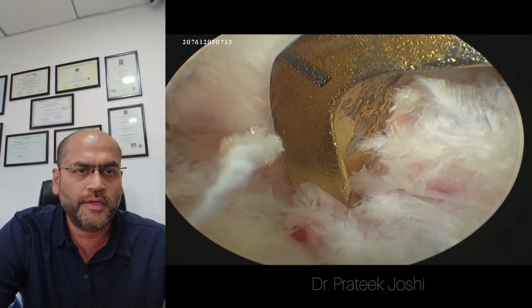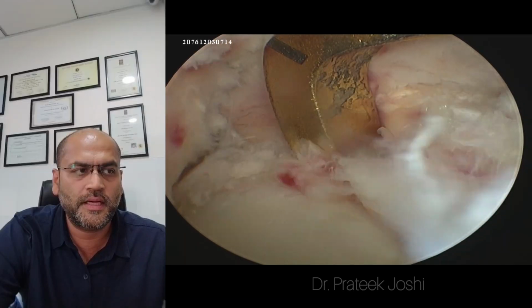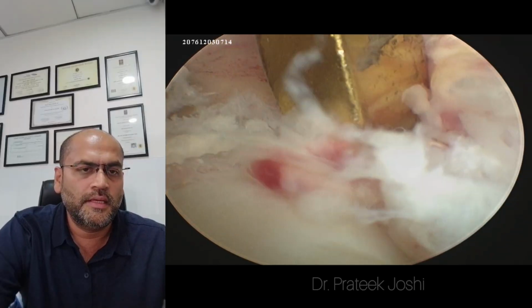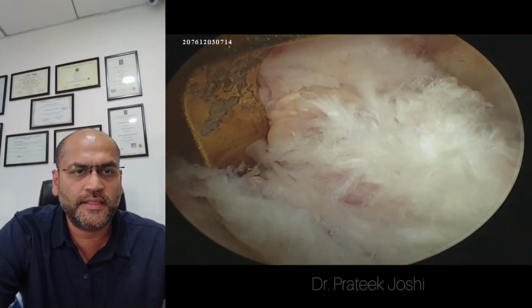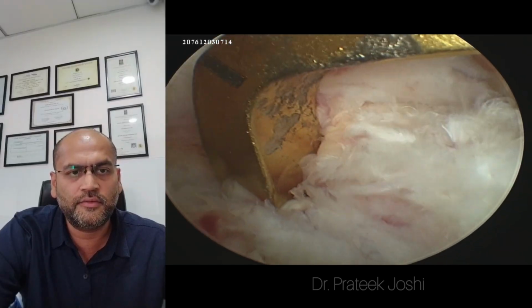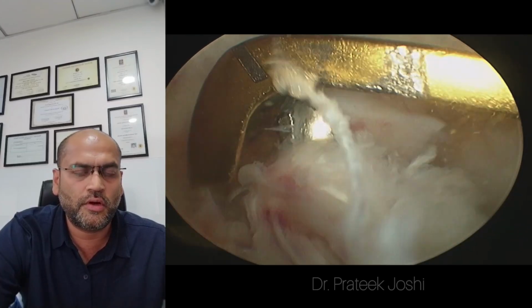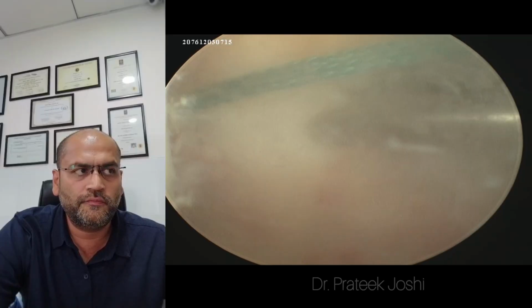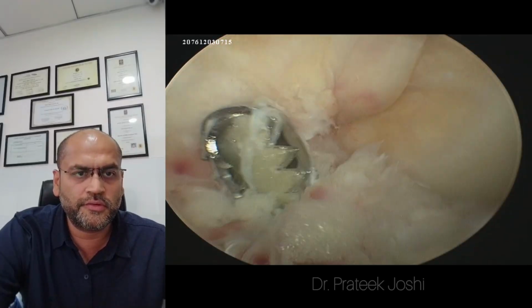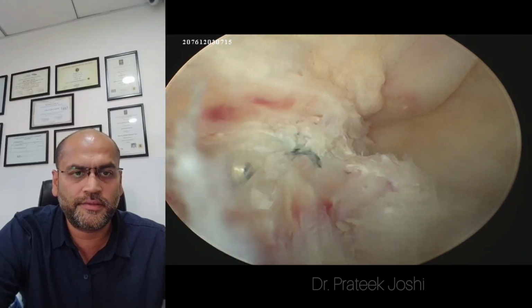Now I am going to drill our tibial tunnel, for which I am going to insert the guide wire from the tibia by using the ACL tibial jig. The jig should be placed in such a way that the guide wire exits just posterior and medial to the anterior horn of the lateral meniscus. This is the perfect position of our guide wire, on top of which I have drilled with a 9 millimeter drill bit because the diameter of our graft at the tibial end is 9 millimeter.